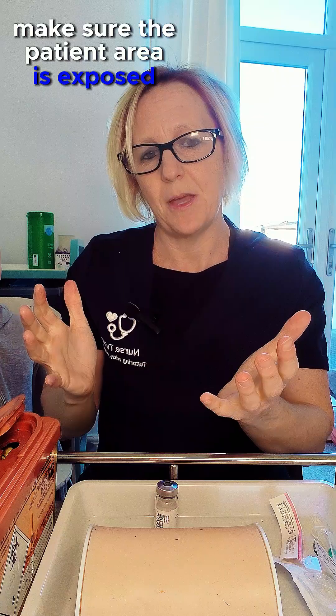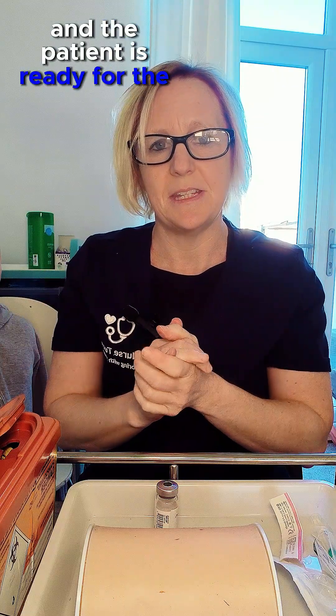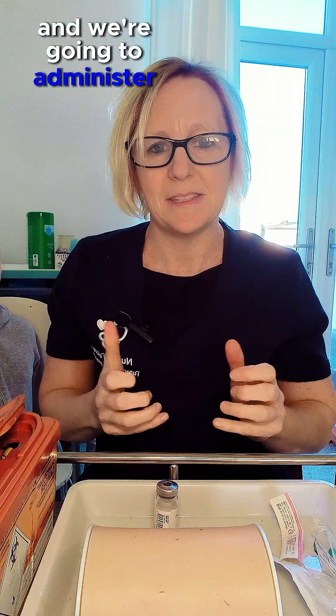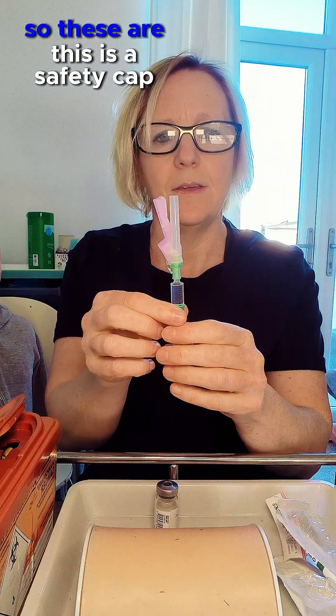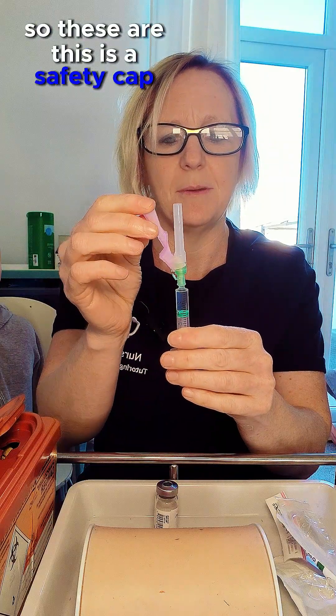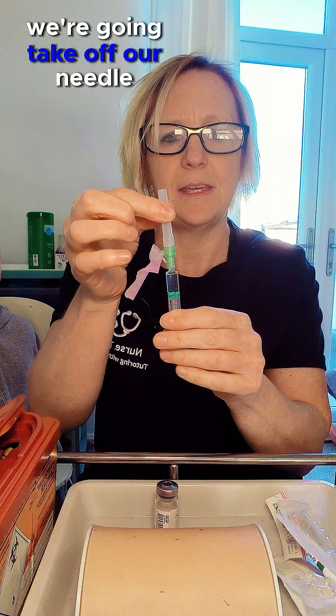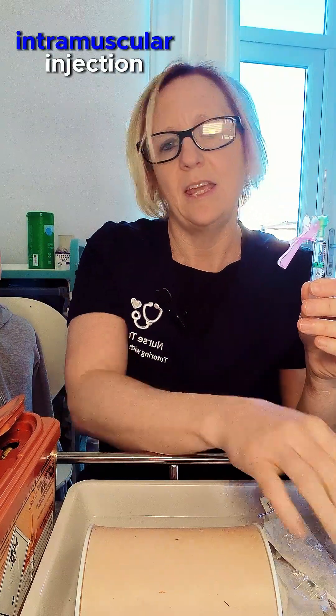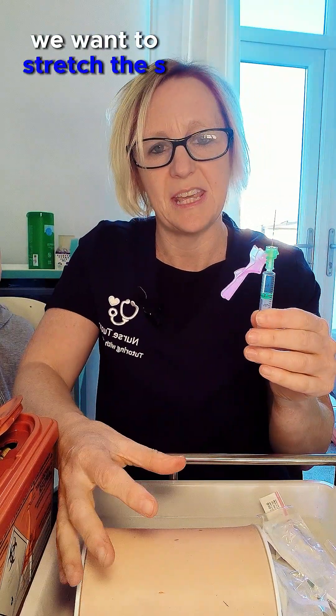We're going to make sure the patient area is exposed and the patient is ready for the procedure, then decontaminate our hands again using the WHO seven steps. This is a safety cap so we're going to put this down and take off our needle cover. When delivering an IM injection we want to stretch the skin.